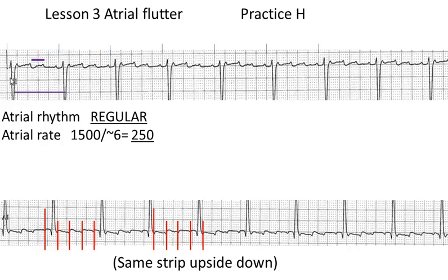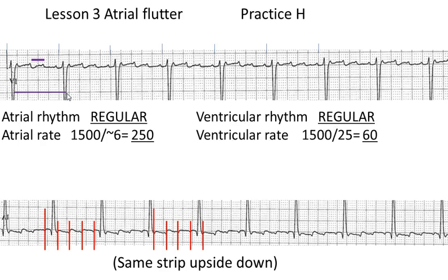The ventricular rate is very regular in this strip, with about 25 little boxes between QRSs, giving a nice regular rhythm of 60 beats per minute. If you took 60 times roughly four, you'd get approximately 240 — so you can see there's a relationship here between the flutter rate and the ventricular rate.